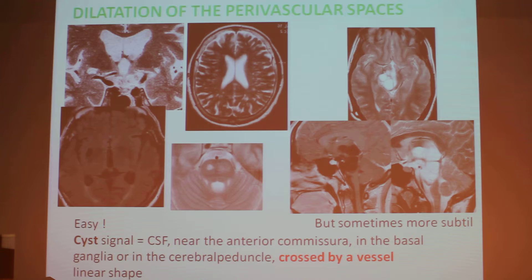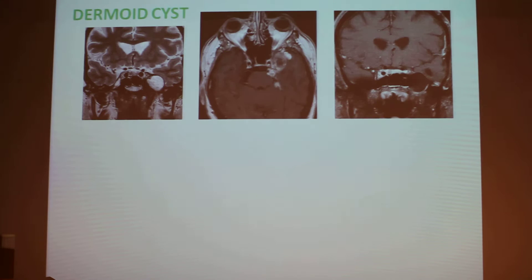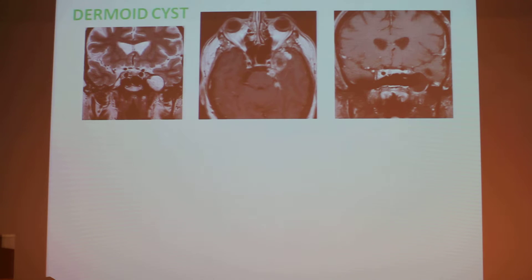This patient was completely asymptomatic. He had an MRI because his grandfather had an aneurysm and he just had a checkup for the brain. We discovered this, followed it, and he has no signs. It is really big perivascular spaces. They can appear with cysts which is more complicated, with a lot of things inside, and often a diffusion that is normal — no restricted diffusion.